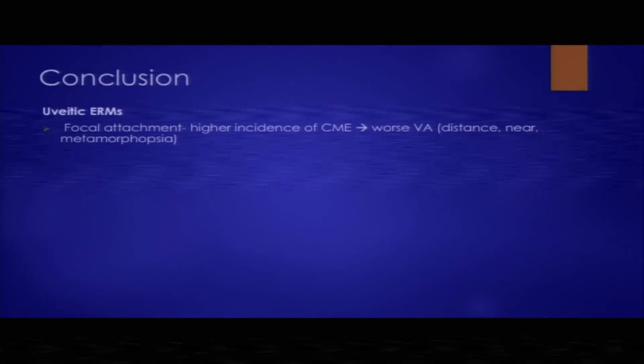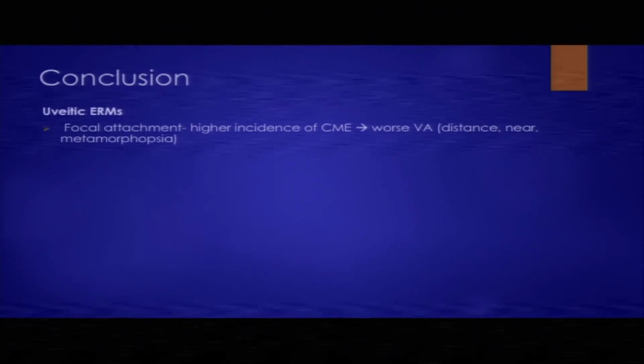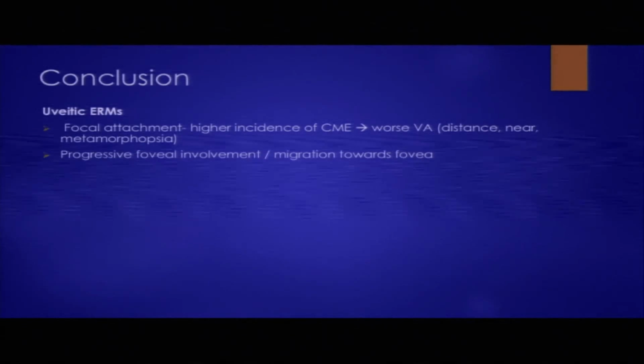In conclusion, uveitic ERMs with focal attachment have a higher incidence of cystoid macular edema, and therefore worse visual acuity. Progression patterns involve more foveal migration. Once the ERM is established, progression will occur despite inflammation control. And ellipsoid layer defects progress despite inflammation control due to mechanical forces of the ERM. This study serves as a guide in tailoring proper follow-up and management.